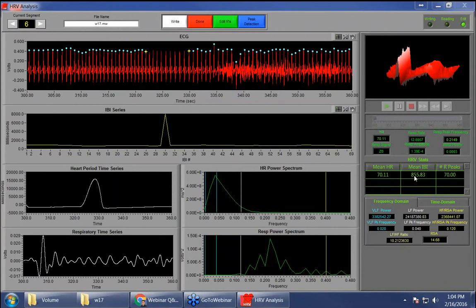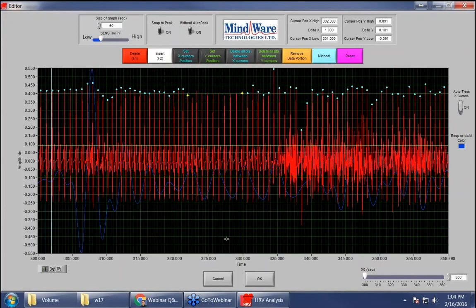so that went up all the way to 855. So that's obviously not what you want your interbeat interval, your mean to be. So the only way you could really get around this is, hopefully it's before you still have 30 seconds of continuous data. So let's just put these back in here. Okay, so what you could do is if the noise basically occurred at any point before that 30-second mark, which is right here, then what you would have to do is you would have to come in here and delete everything either before or after that. That's how you would kind of get around that, just like that.